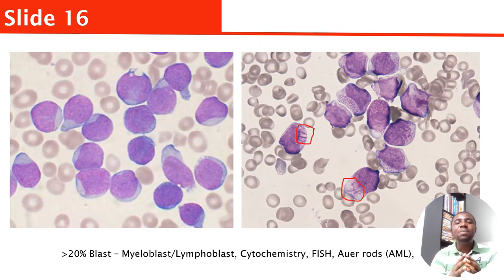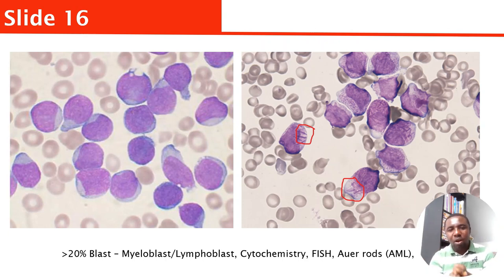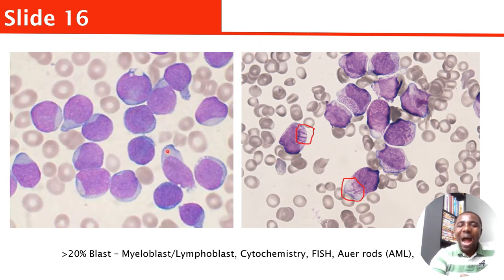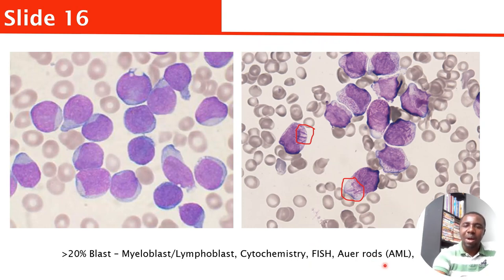This is mainly common in acute leukemia — whether acute lymphocytic leukemia, ALL, or acute myeloid leukemia, AML. There are a lot of blasts, greater than 20%, so start thinking acute. To differentiate whether it is ALL or AML, look for Auer rods — that thread-like line inside the blast cell. Auer rods are common in AML. This is how you differentiate the two types of acute leukemia.